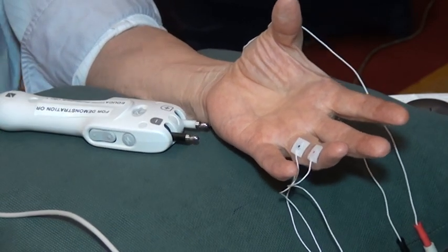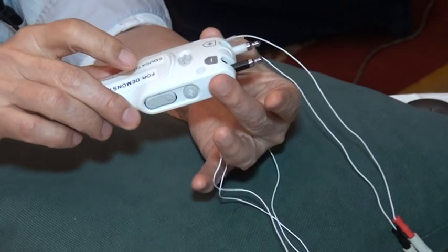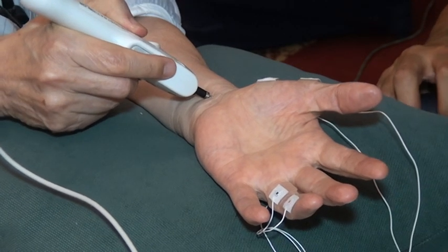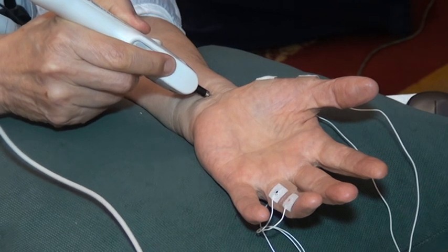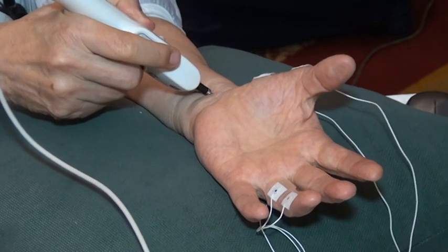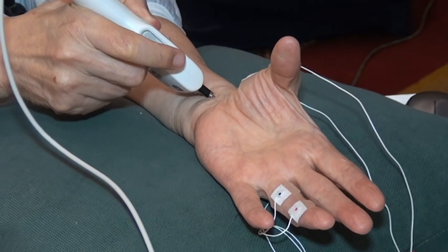So that's why when you do repetitive stimulation, you have to keep the muscle in the same position. Let's say one hertz, right? Let me make sure of that. Let me show you something else. Okay, let me show one shot, right? One shot, just yeah, okay. But then you erase that, and you tell me when. One hertz, right? Yes, okay.